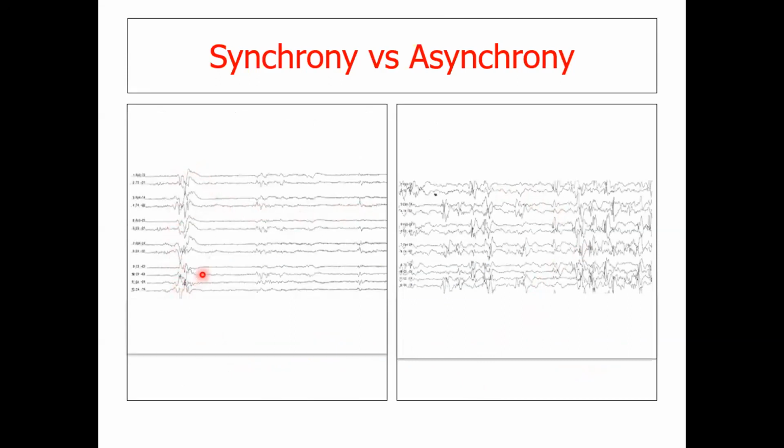So this is a synchronous record. In fact, it is more or less hypersynchronous. These waveforms are coming from both sides together. Here, you can find that they are occurring with a time gap. This is an asynchronous record.